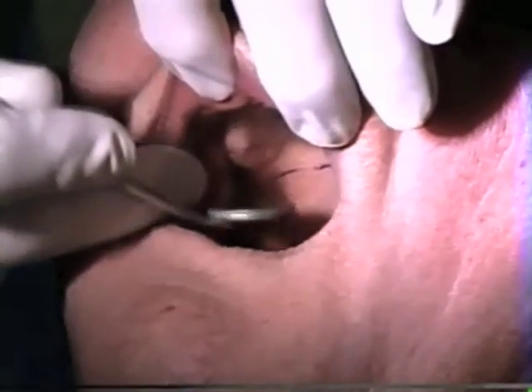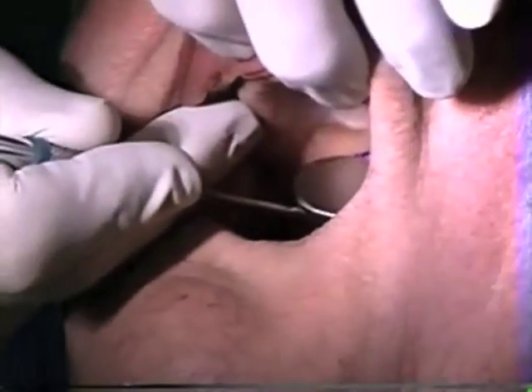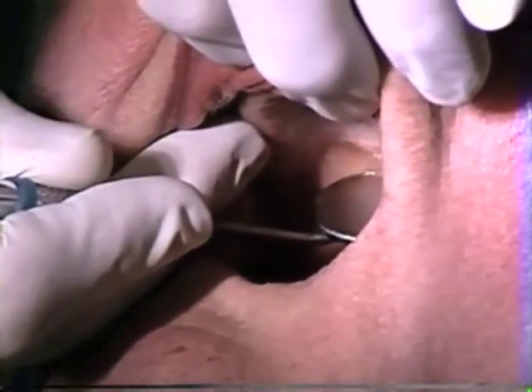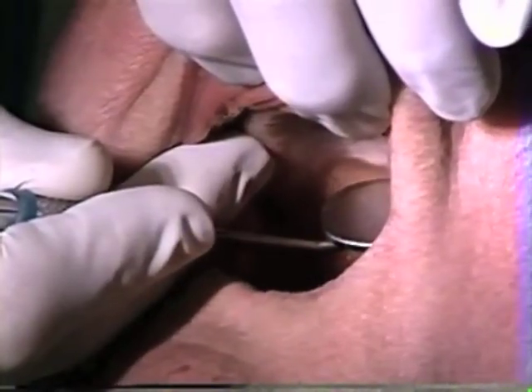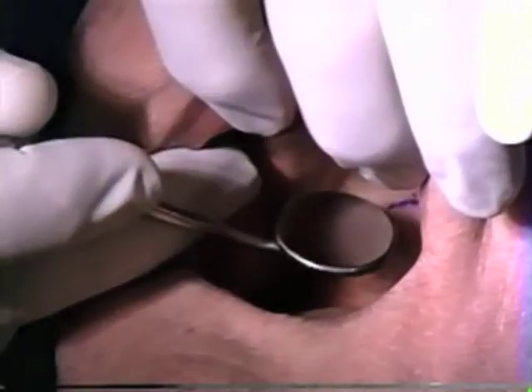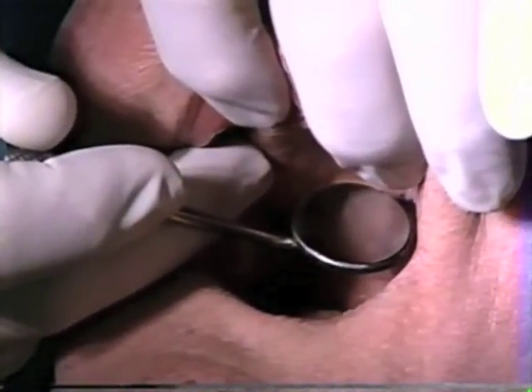Now say ah, and you can see that mark moving up and down. If you steady a mirror over it and say ah, you'll see the mark moving up and down; then move the mirror forward. About three millimeters in the midline is the point you can find. That is the junction between the movable and immovable tissue. You need to evaluate the position of that line.